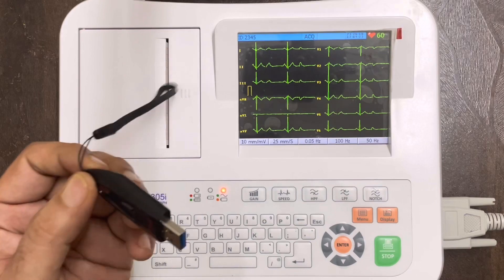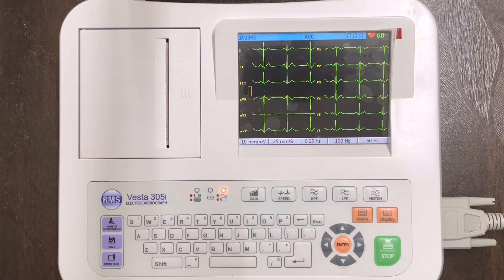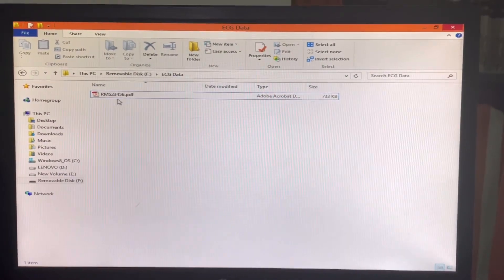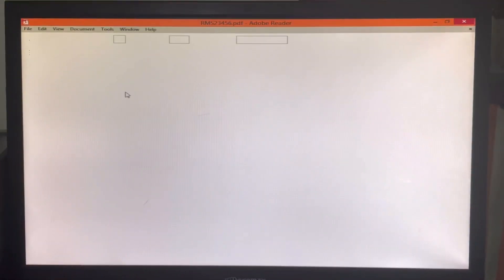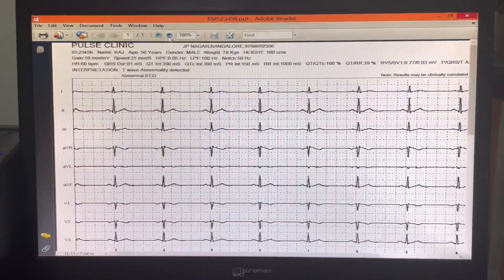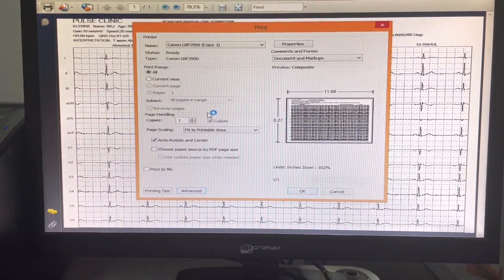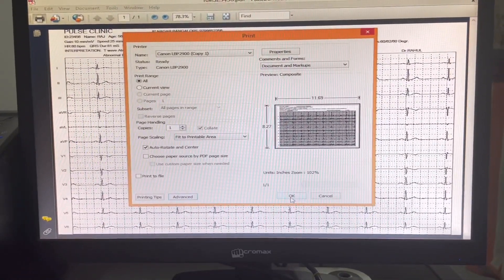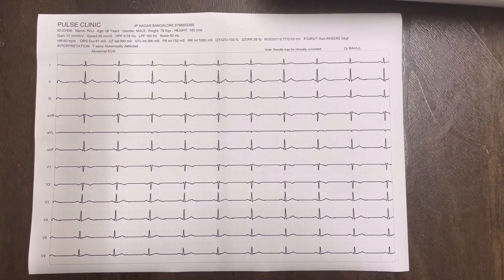Now take the pen drive from the ECG machine and insert it into your laptop or system USB port. A file with the patient ID will appear in the pen drive. Double click on it and you will see the full disclosure of all waveforms along with clinic information and parameters. Click print and then OK, and finally you will get the printout from an A4 printer.